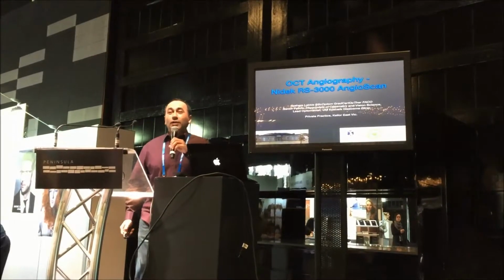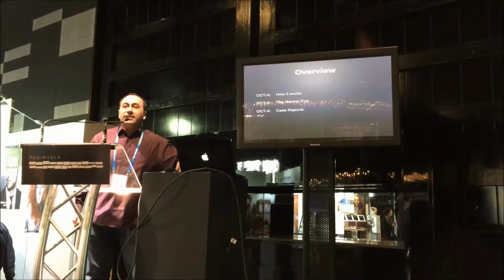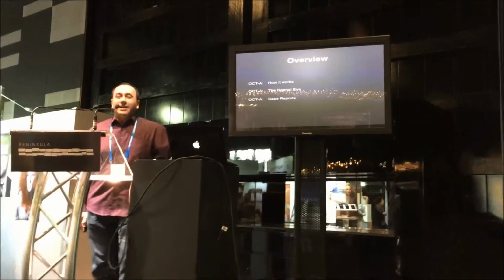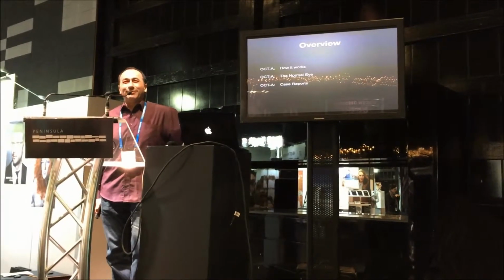I'm going to take you through a quick tour of OCT angiography. What we'll talk about today is how the technology works in brief, what the normal eye looks like, particularly Cameron's eye, and some case reports of patients I've seen.